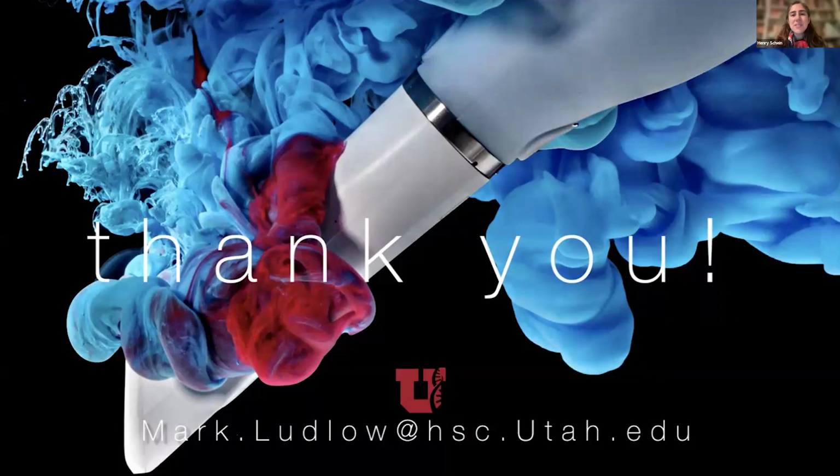This next one is from Dr. Cynthia Levenka. Do you take PVS impressions when you have subgingival margins? Yes. It all comes down to how good I can isolate it. Okay. We've all had those ones. And again, I especially get them as a prosthodontist because I get interesting cases sent to me. Let's just say that. But the reality is, we've had those that are 90 feet deep. Okay. They're bleeding like a sieve.